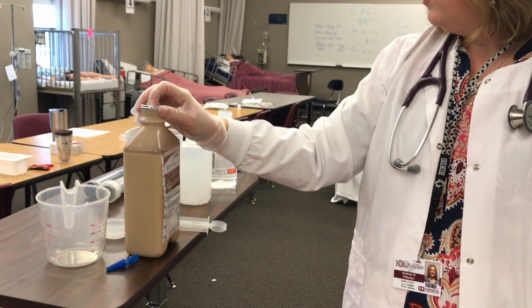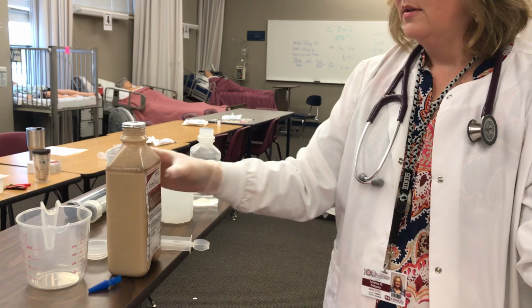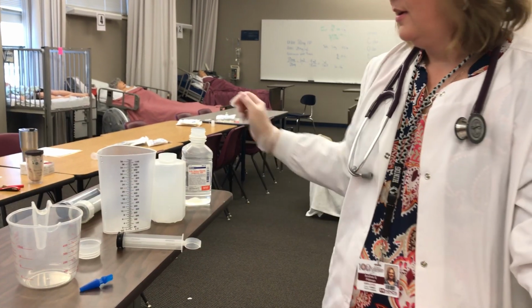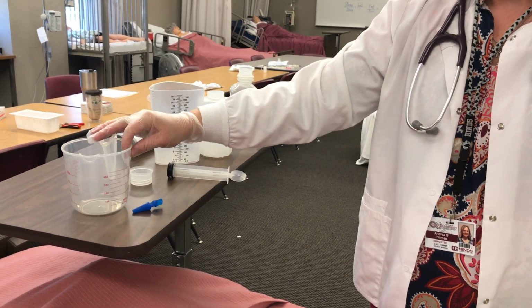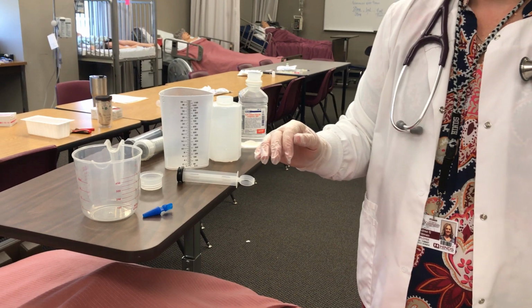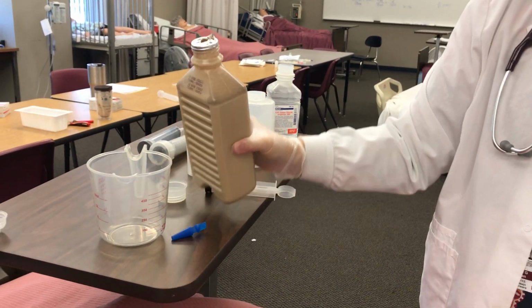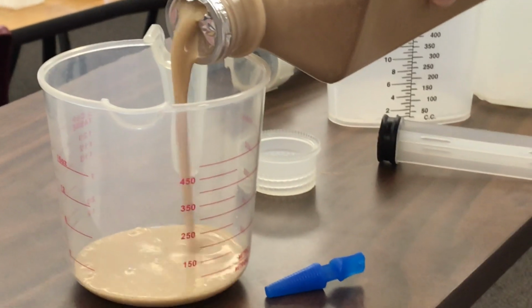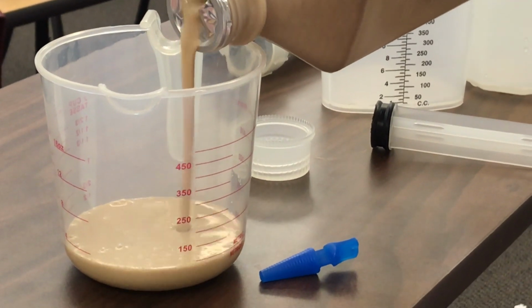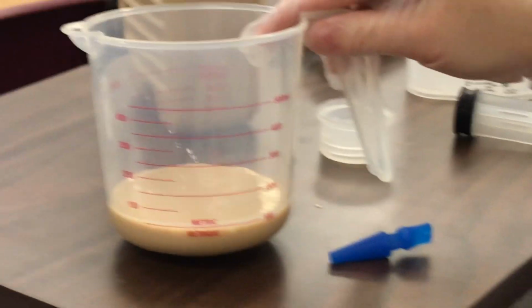If it does have a cap, we'll just break the seal and then we'll pour up 100 cc's of our feeding. You can see that that's 100 cc's.